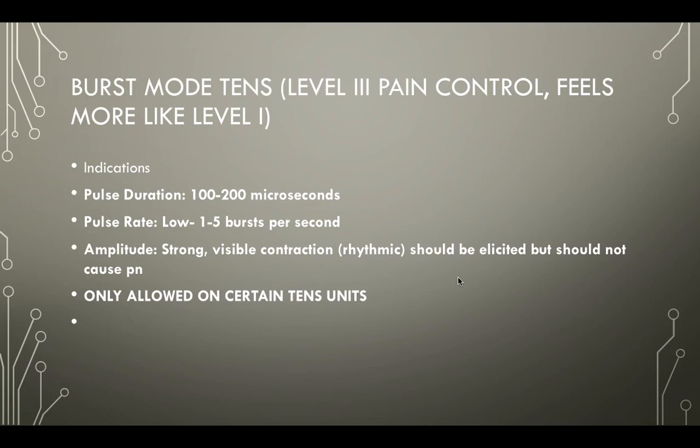But like I said, I'm not a huge fan of it. I would rather just do straight up low rate TENS. So the goal is to elicit those strong muscle contractions, but potentially at a lower intensity than you would need if you did low rate TENS.